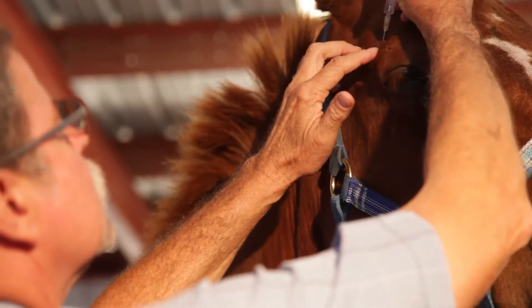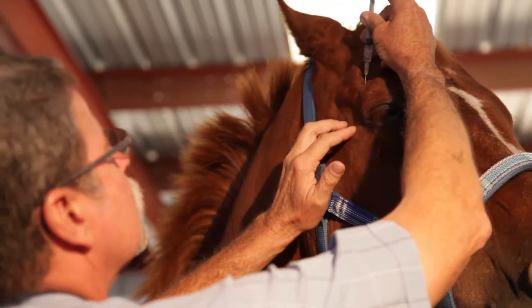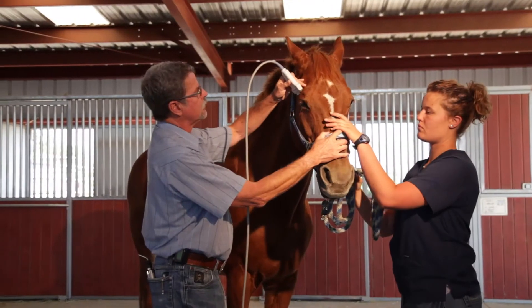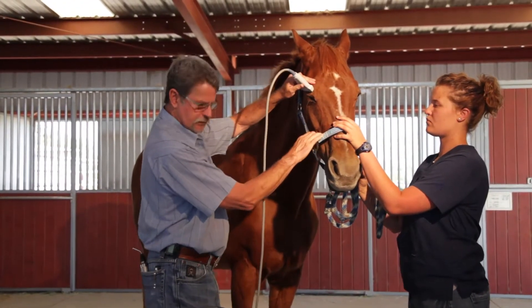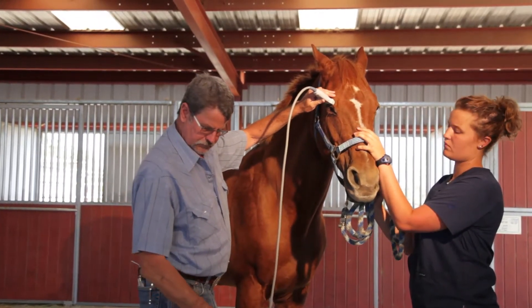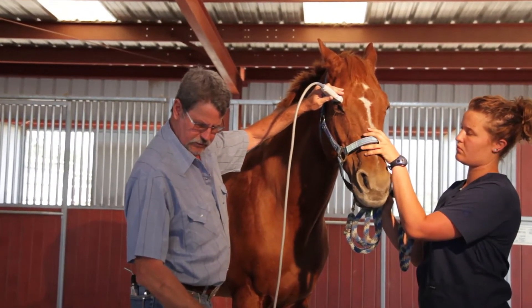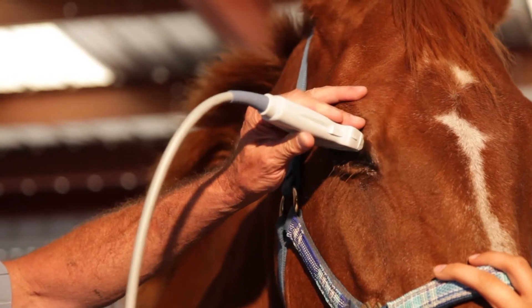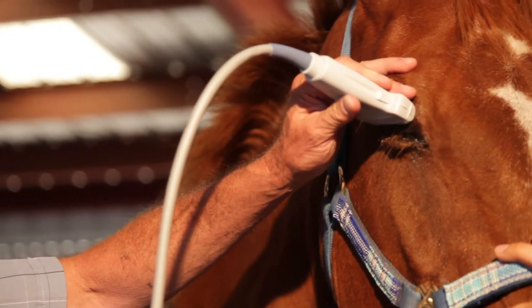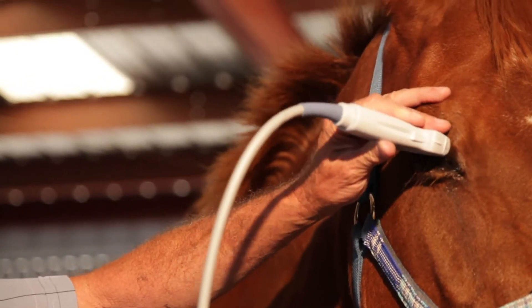Very happy camper, very good patient. I'll do an ultrasound exam of his globe. So far this is a normal ultrasound exam of the eye — you can see his retina and his lens.